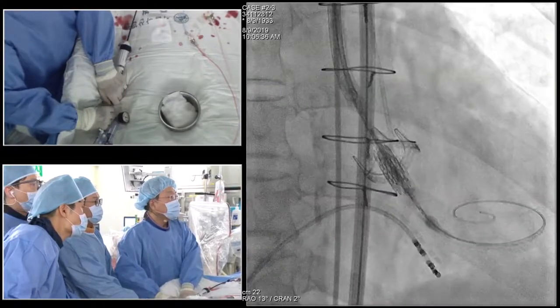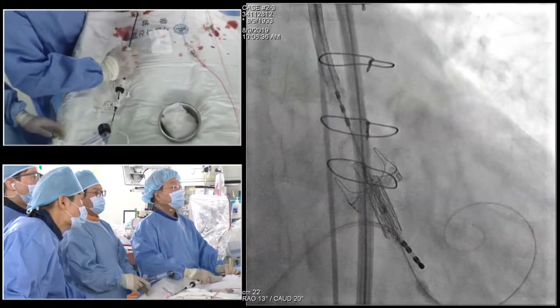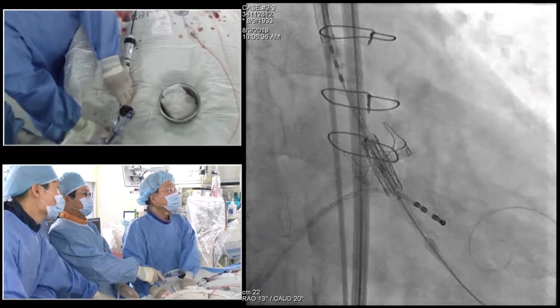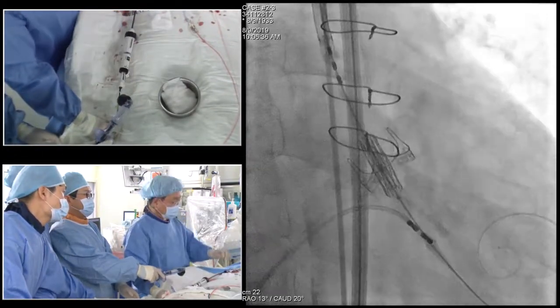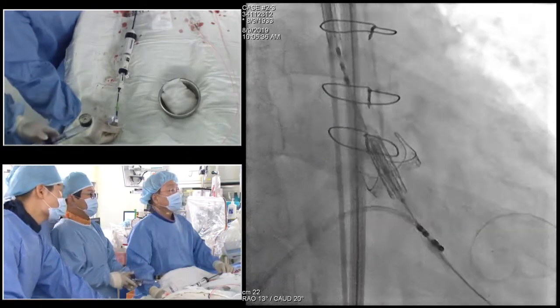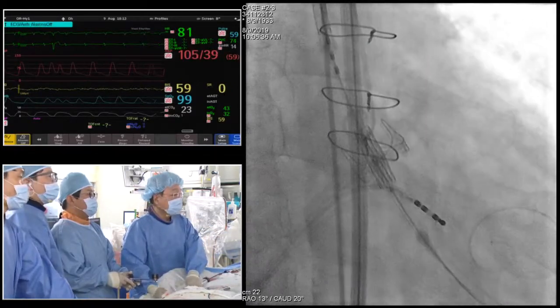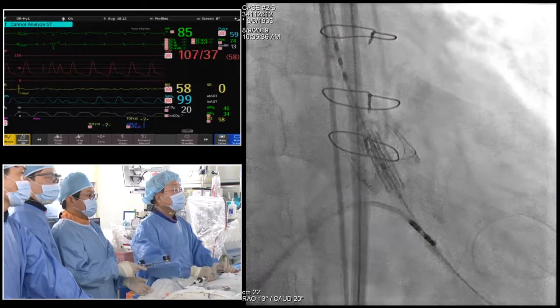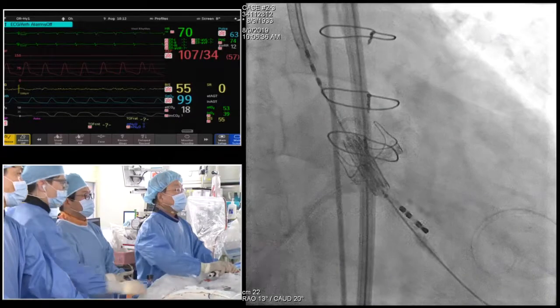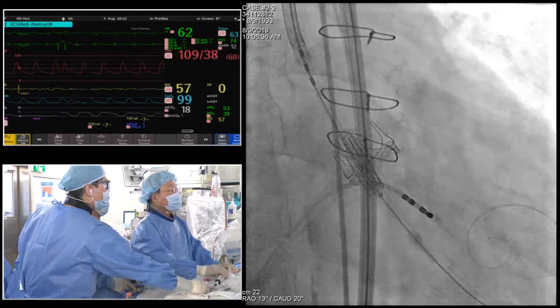All right, push it back down. I want to make this a little bit further coaxial. Yeah, just a little lower. I think I'll go in a little bit. Okay, test it. All right, we don't need that one. What do you think, David? I think it's good. Just go very slowly and be prepared to push it in a little bit. It's already gone in a little. All right, that's good.